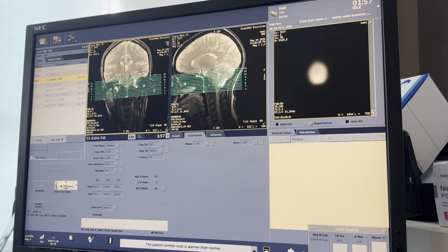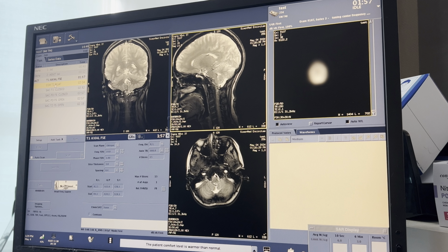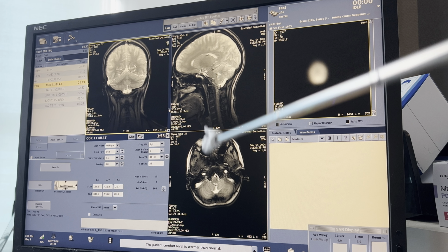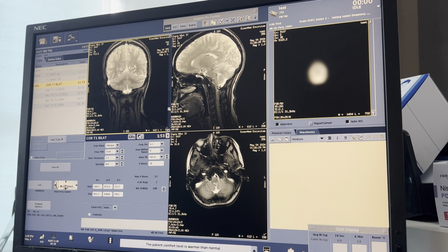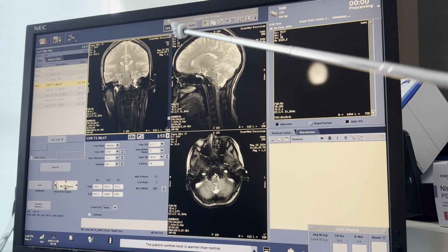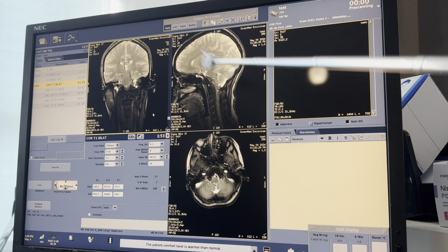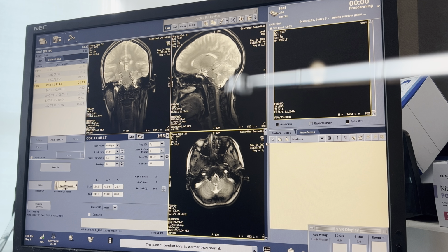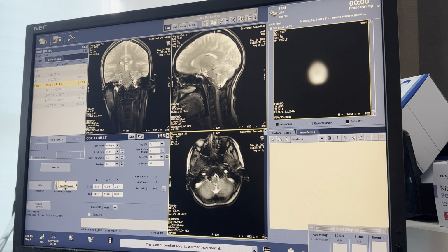Now we're going to go into the coronal. I want you to find Shrek's ears over here. There you go. You could only see one of them right here, really. See the other one later on. Okay, and we're going to wait for our axial for now.